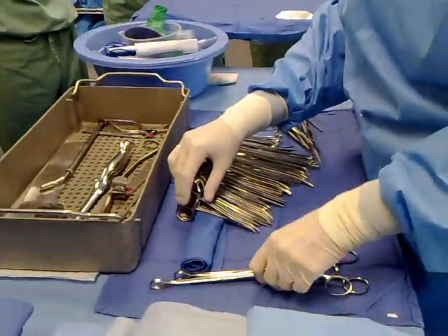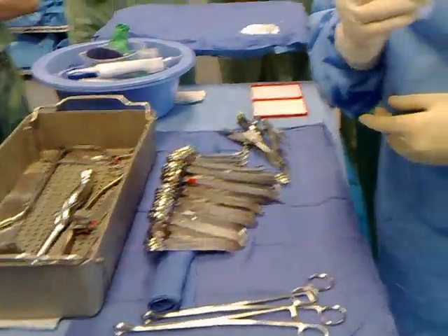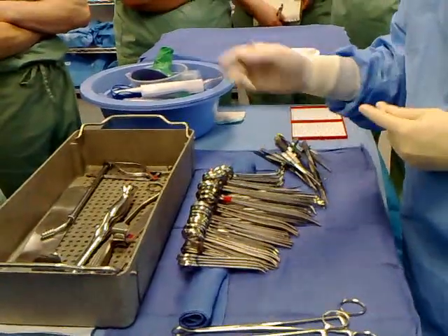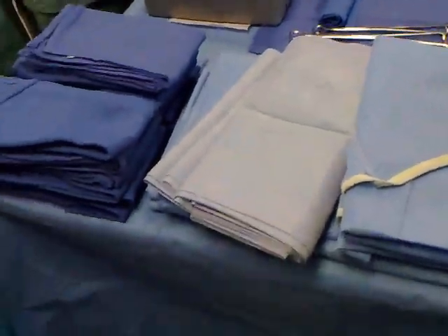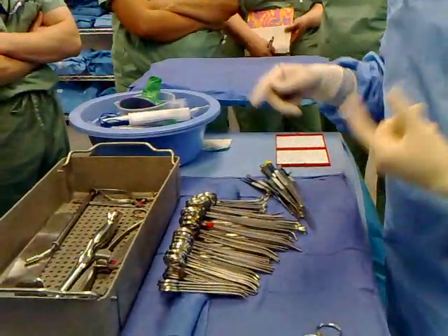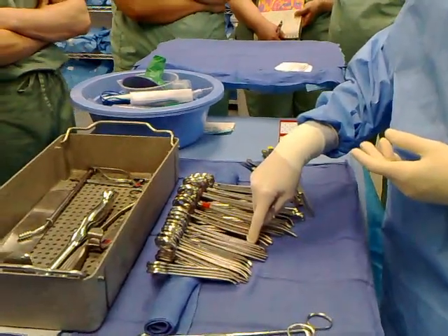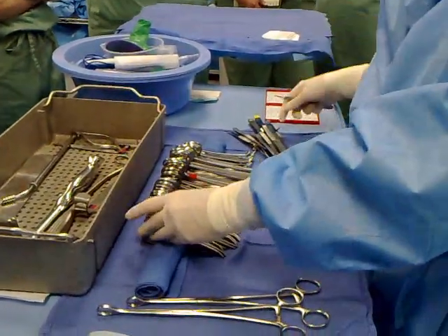So now I'm ready to do my counts. Your circulator has the list, right? And you have a pen because if it's wrong, you have to change it. It doesn't always match exactly what you have here. You may have something extra — for example, my surgeon likes to use a special forceps not in this set, and a special scissors. Those are going to be added to the set.